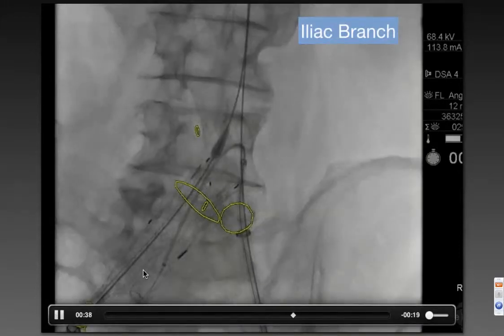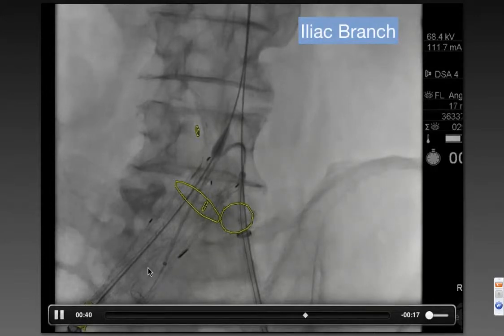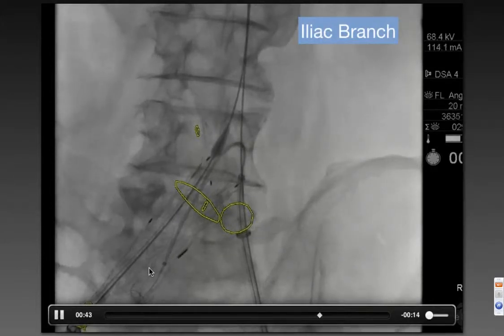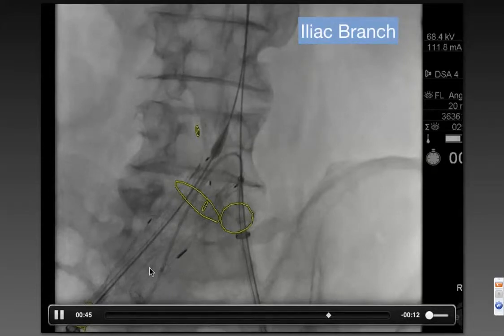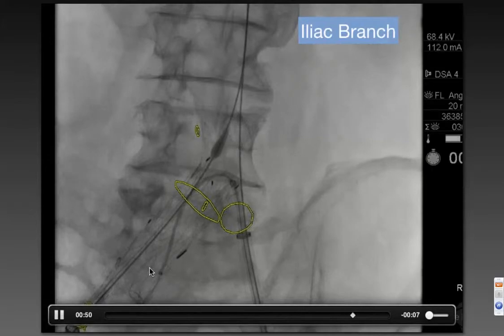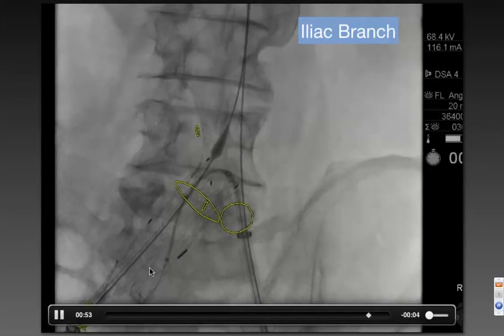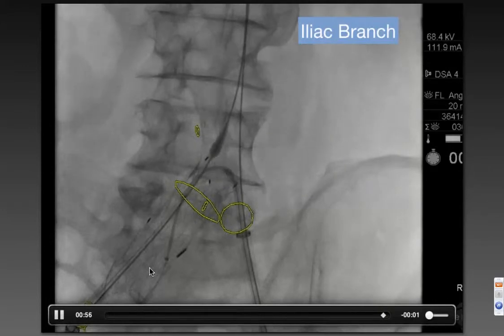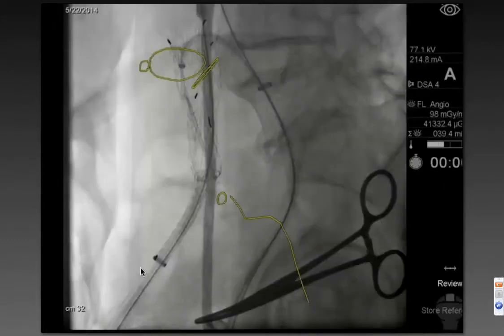That's really challenging to do under any circumstances, but you'll see we can actually do it reasonably easily. We still have kind of one false pass there. Here we're pulling everything back into position and then we're going to bump forward. With these little buttons, you can actually bump this forward. If it looks like it's pulling the diagnostic back out of there, you can put a little bit more bend in it, and then you can just gradually advance up and over the bifurcation.